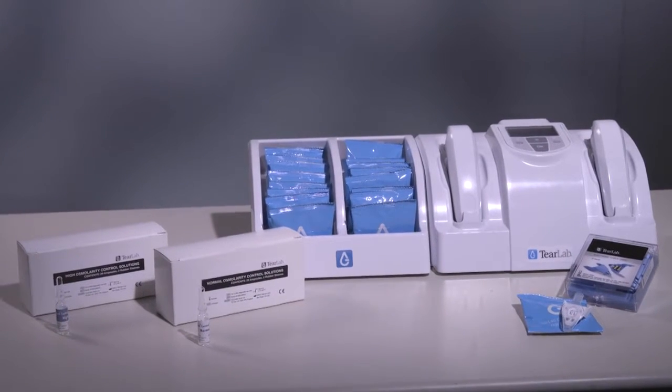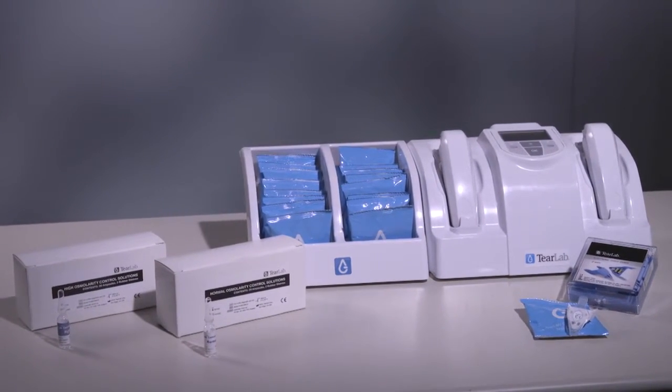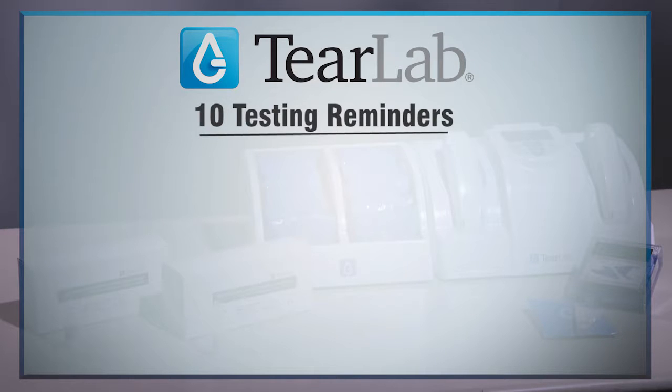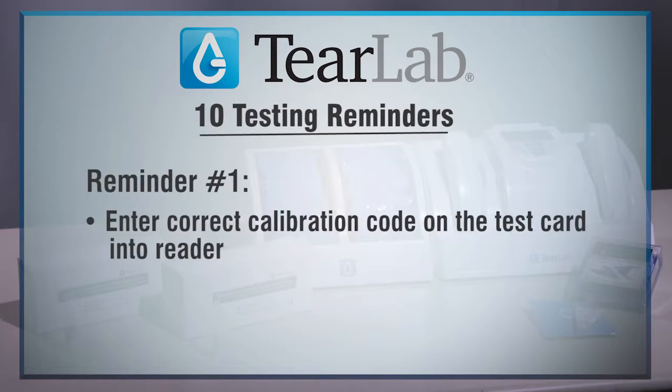If you are new to TearLab or need a review, this video provides an overview of 10 TearLab testing reminders. Reminder number 1. Enter the correct calibration code on the test card into the reader.